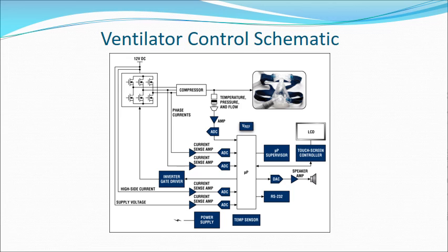But the basic idea here is that you have feedback of temperature, pressure, and flow from the patient circuit, which gives the control circuit or microcontroller the knowledge of how to control the compressor or turbine.